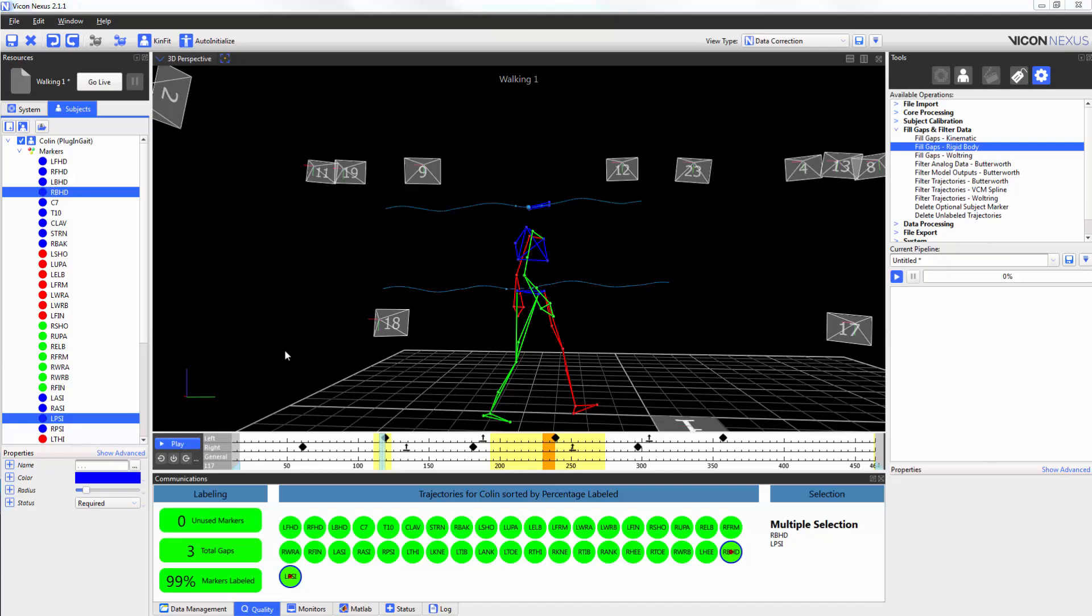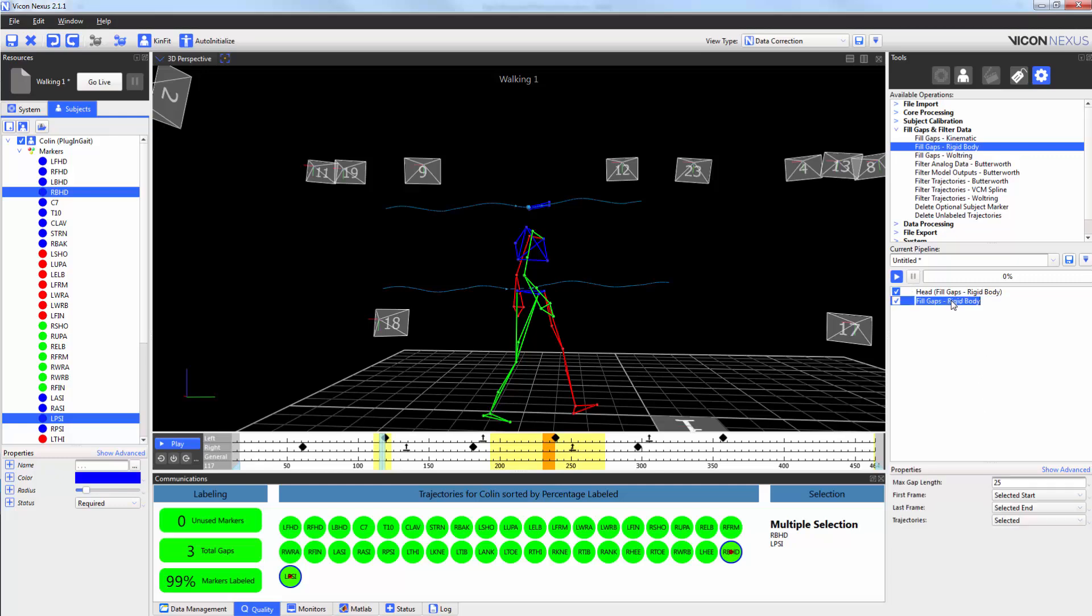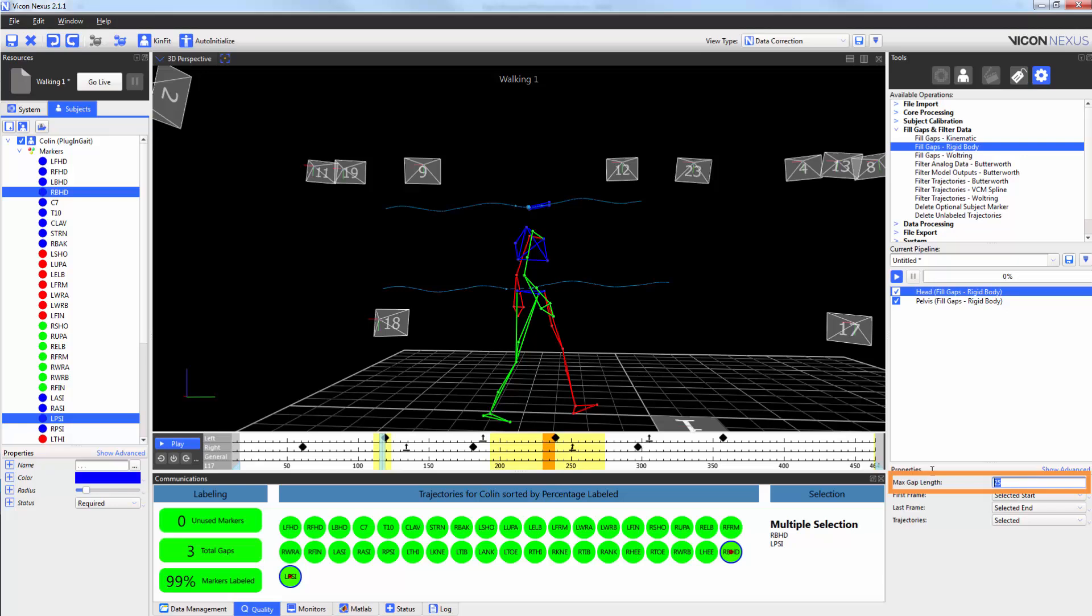As such, I'm going to use two pipeline operations, the rigid body fill gaps, twice. I can now double click on these to give them the appropriate names. I can also change the maximum gap length. In this case, I'm confident that my data is good. So I'm going to change it from 25 frames to 50.